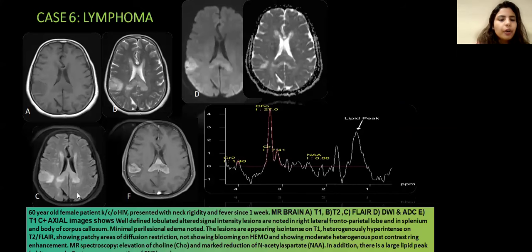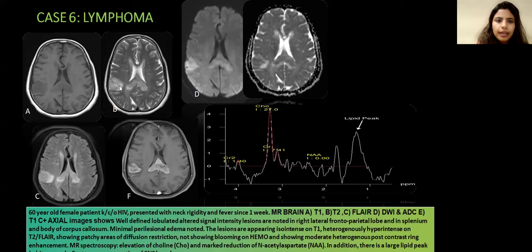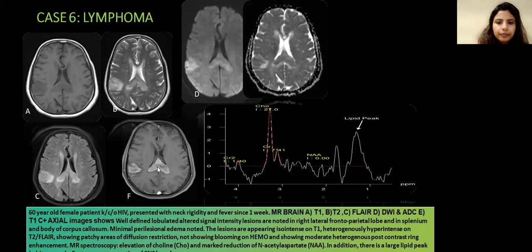Next case: 60-year-old female, known case of HIV, presented with neck rigidity and fever since one week. MR brain T1, T2, FLAIR, diffusion-weighted, and post-contrast T1 axial images showing well-defined lobulated altered signal intensity lesion in the right lateral frontoparietal lobe and splenium of the corpus callosum, with minimal perilesional edema, appearing isointense on T1, hyperintense on T2 and FLAIR, showing patchy diffusion restriction and contrast enhancement. On MR spectroscopy, there is a choline peak, reduced NAA level, and lipid lactate peak, suggestive of CNS lymphoma.